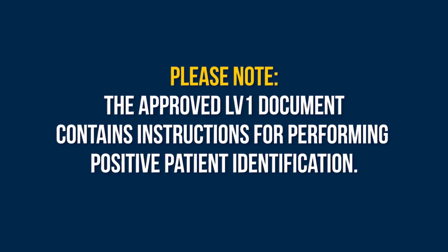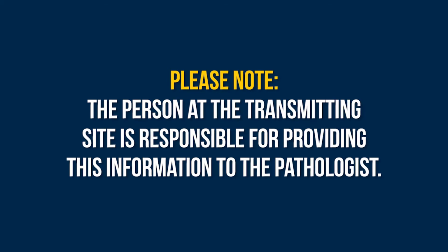Communicating. Please note that our approved LV1 procedure document contains instructions for performing positive patient identification and other information that the person at the transmitting site must provide to the pathologist prior to initiating diagnostic frozen section slide review.